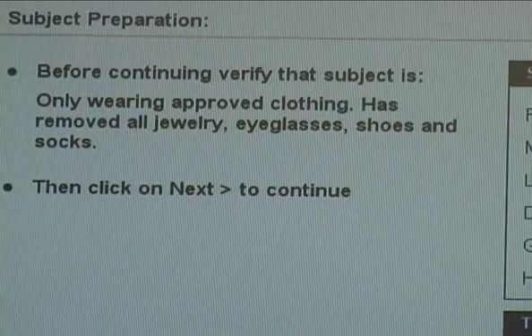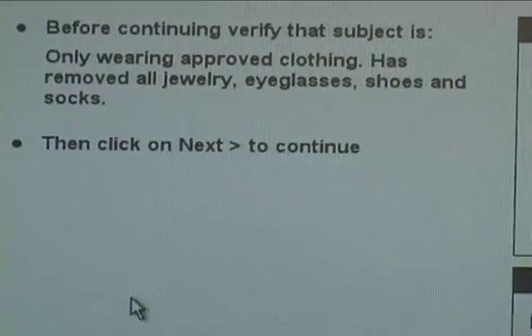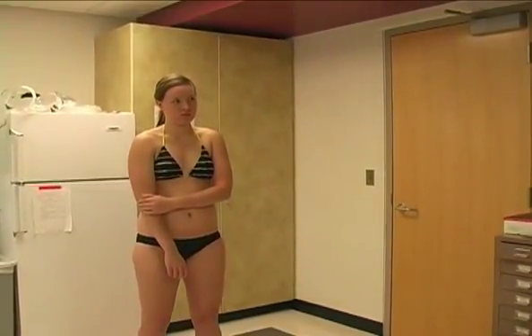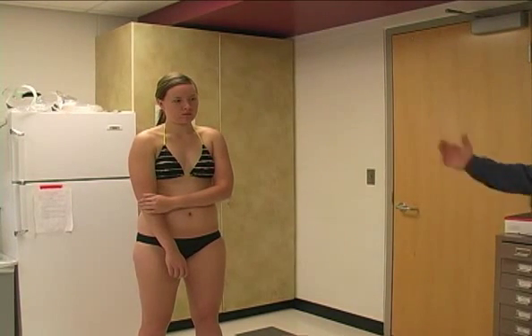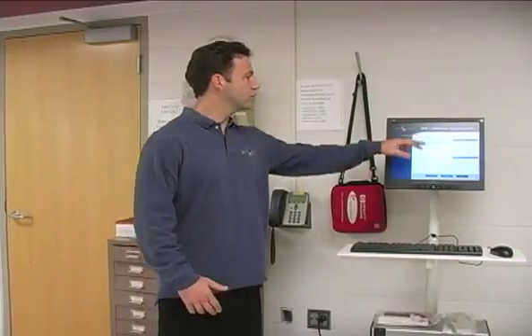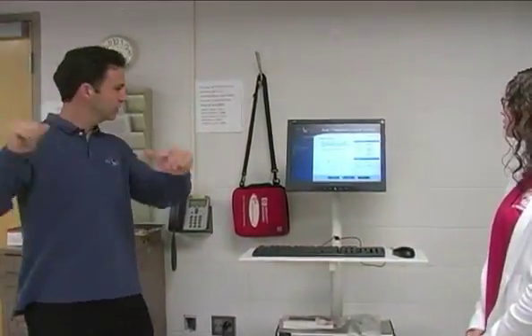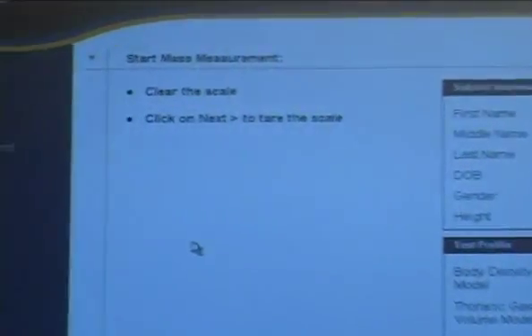You want a two-piece bathing suit, one-piece bathing suit, or a sports bra and compression shorts for a female. Guys would be a Speedo swimsuit or compression shorts. The reason is you want tight-fitting clothing. You don't want Brittany to come in with a skirt hanging, or what's it called, a sarong, or whatever one of those things are. So this reminds you, just to check, okay, she looks great, click next, she's got proper clothing protocol, because if she doesn't, it affects the test.